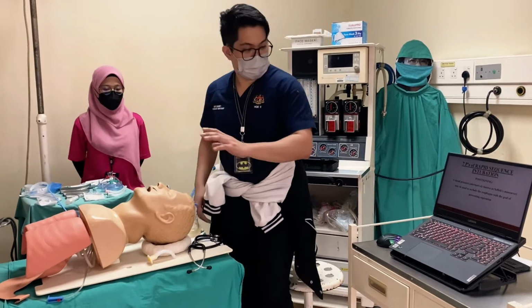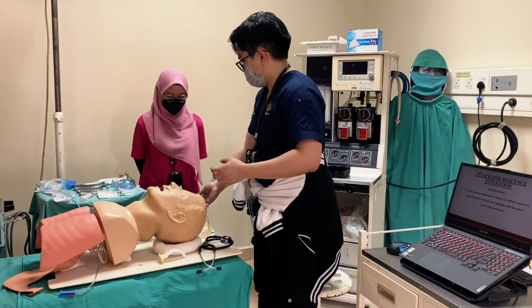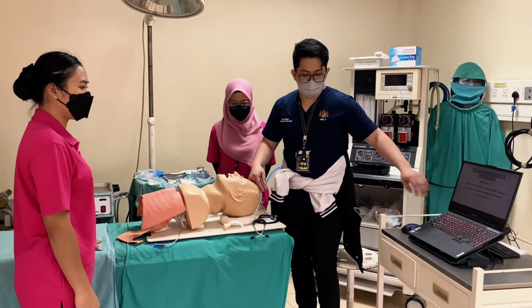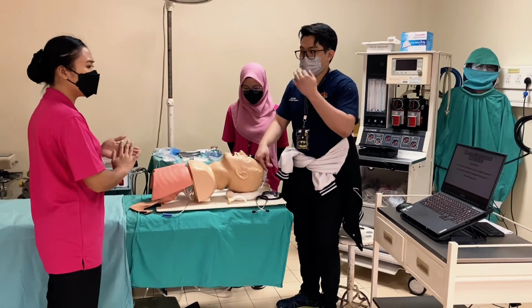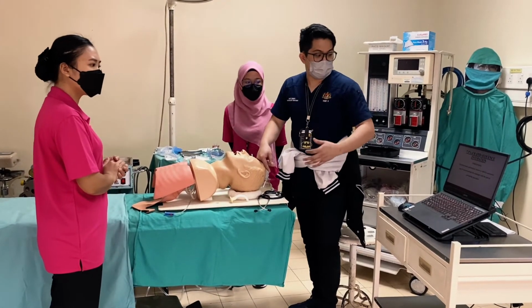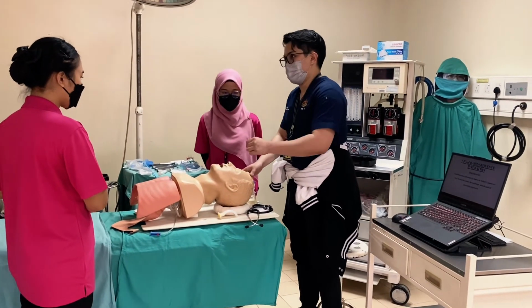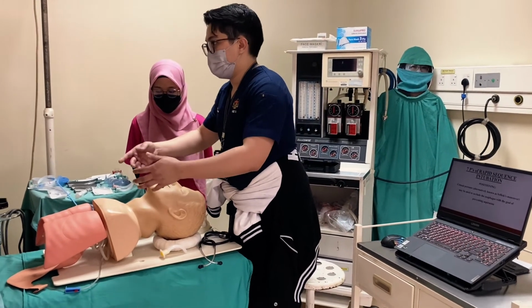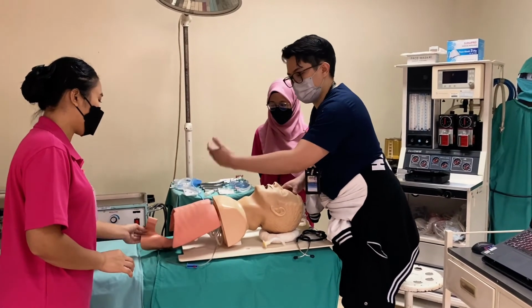As I said before, we need one assistant from here. Okay, don't worry, just come. We showed the positioning. The next phase of rapid sequence intubation is cricoid pressure, or what people call the Sellick maneuver. It may be used to occlude the esophagus with the goal of preventing aspiration. Because when we give muscle relaxation to the patient, it is not only about breathing, but peristalsis will not be working.